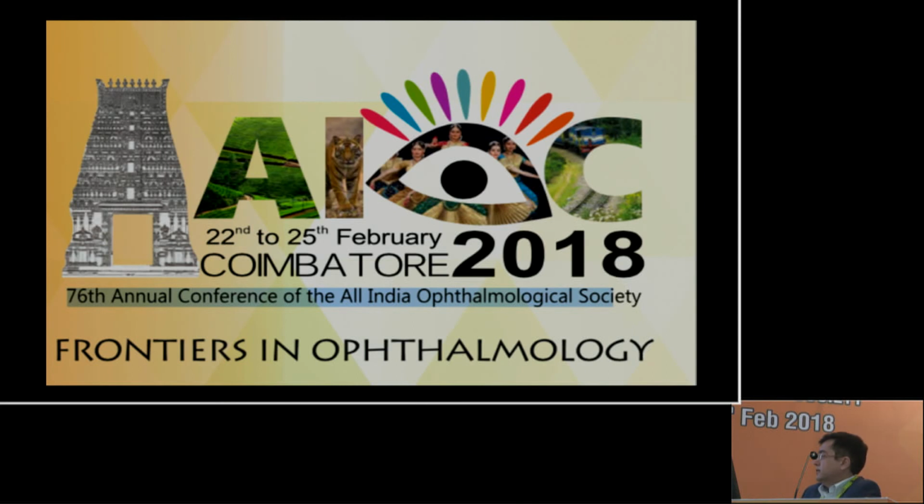The other giveaway is, for example, I have a NIDEK AL-Scan. It gives you the central pachymetry also. So you can just take a look at it. If it's something like 400 something or 300 something, yeah, you have to really get after the patient.